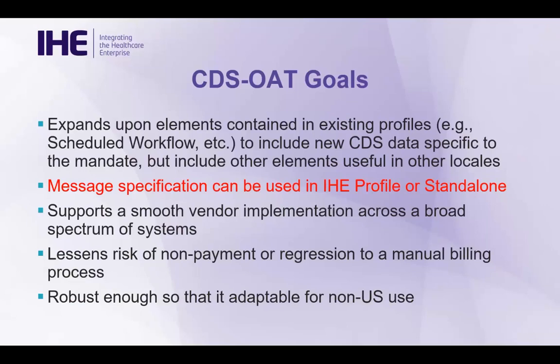The integration workflow is good, but we know that some of the existing hospitals don't necessarily strictly follow some of the workflows, while the message specification to communicate the CDS information is still perfectly valid and usable in other contexts. So for many of the audience in this webinar, if you fall into one of the two camps that need the CDS information, this profile is still highly valuable for you.